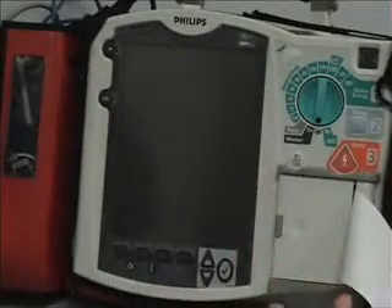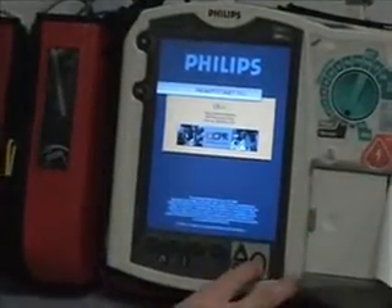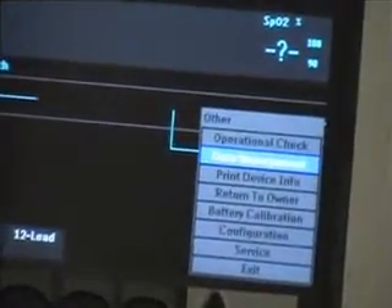Once you've finished your call and you want to do your event summary or code summary, you'll turn your monitor on and go to the data management menu. Hit Menu and scroll down to Other, then select Other, then Data Management. It's going to give you a warning — you're leaving the patient monitoring mode — so you always want to do this after your call. Hit Acknowledge.